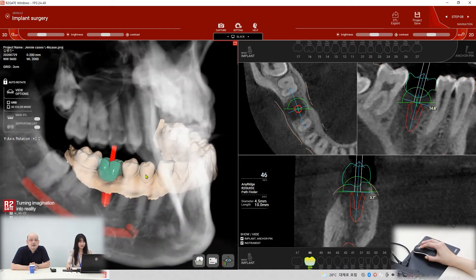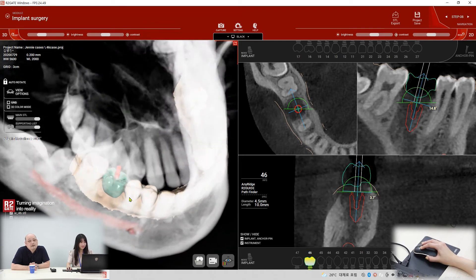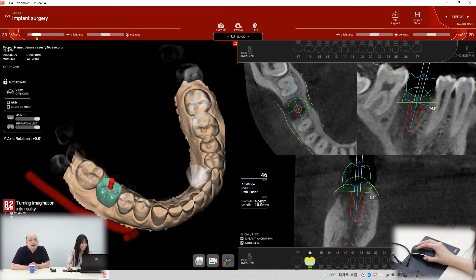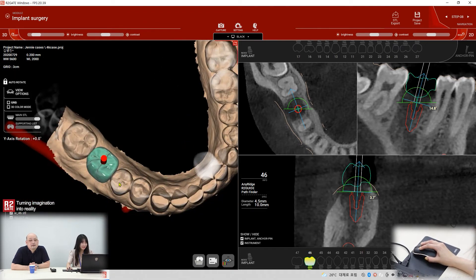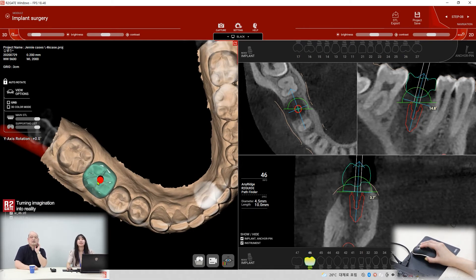Is it a good position? I think yes. That's perfect.